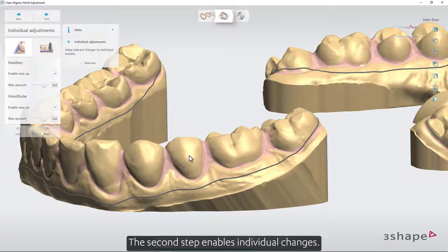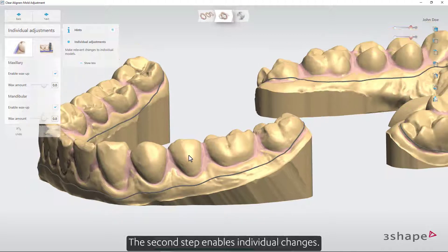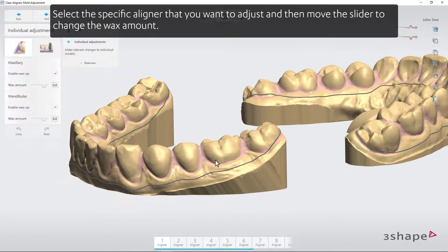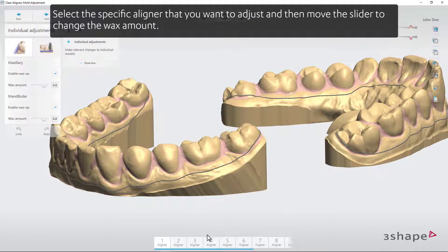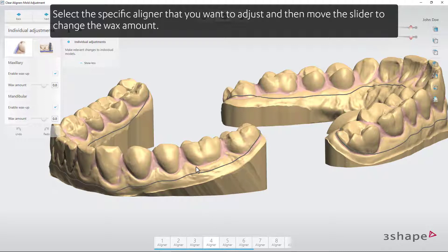The second step enables individual changes. Select the specific aligner that you want to adjust and then move the slider to change the wax amount.